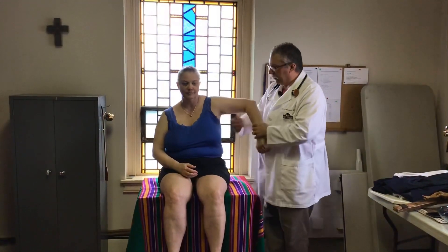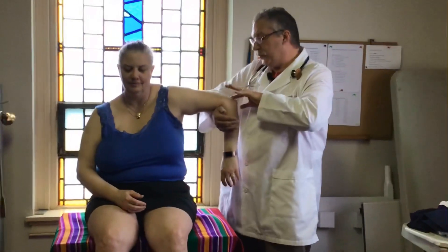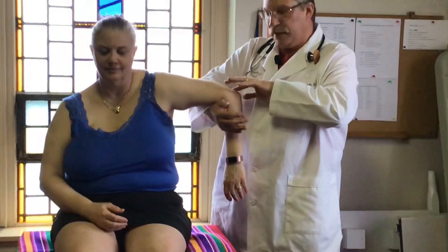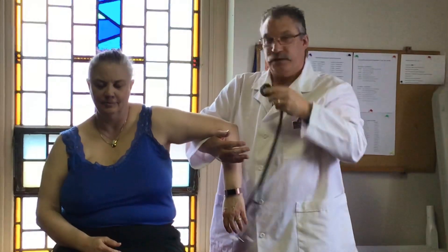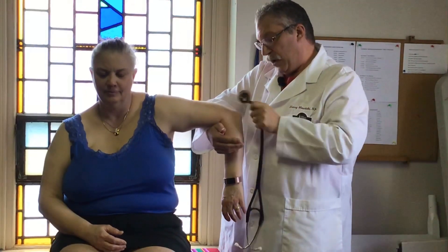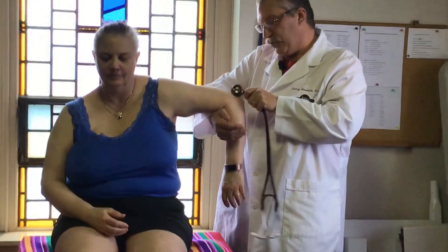The first one we're going to do is the tricep reflex. You're going to cradle the patient's arm and look for the groove right above the elbow — that olecranon notch, right in the middle of that groove. You're going to take your reflex hammer, which is really your stethoscope, and watch down here for the response. Strike right in that groove.